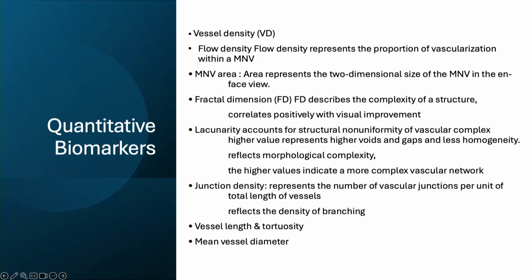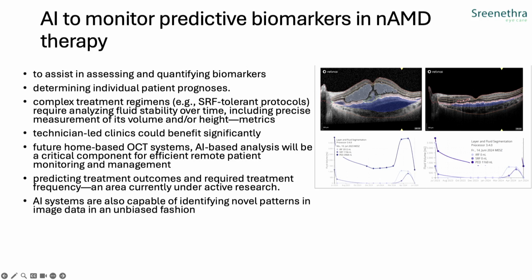There are several other quantitative biomarkers which can be combined with AI to show us the prognosis over time. This can be integrated in an AI dashboard, and then you can actually predict the outcome and the required treatment frequency. So this is all under current research.